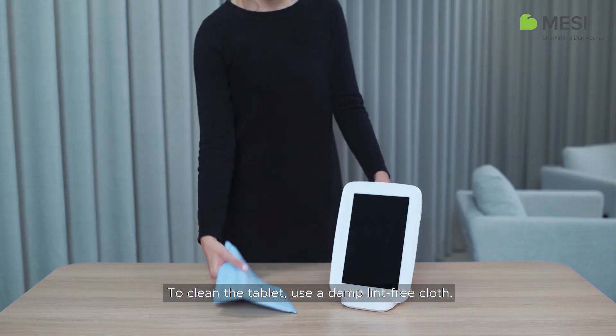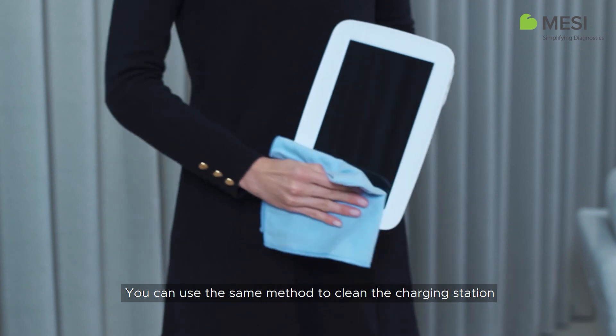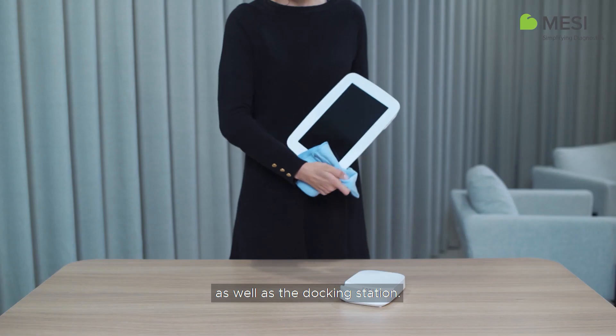To clean the tablet, use a damp, lint-free cloth. You can use the same method to clean the charging station as well as the docking station.